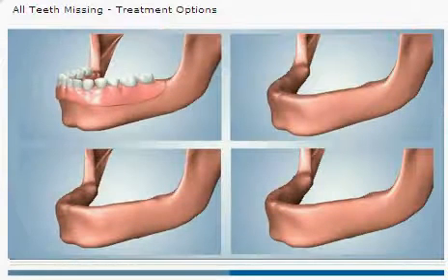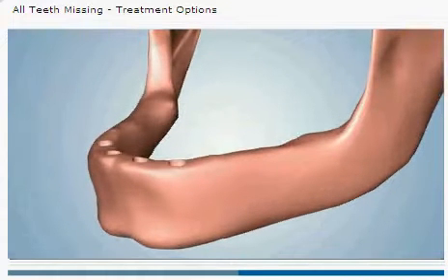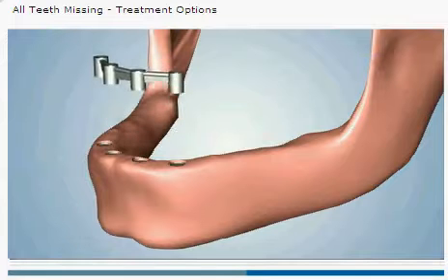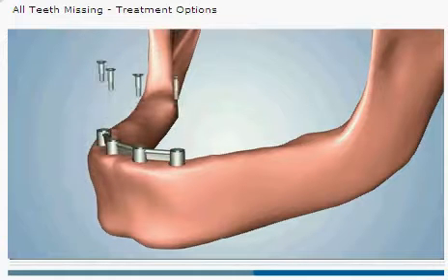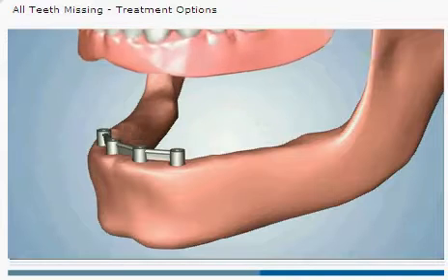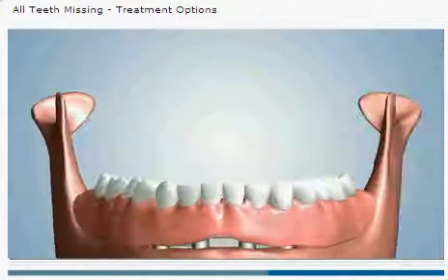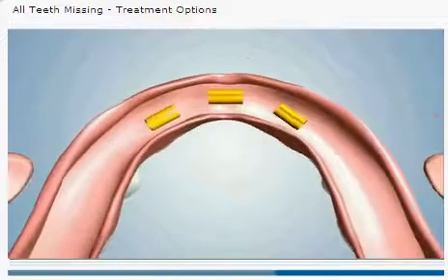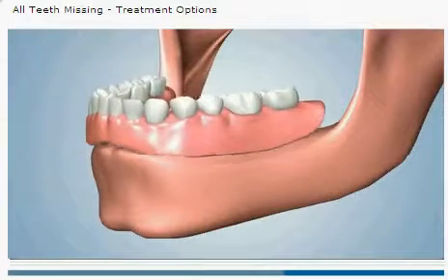A second option involves the placement of four dental implants. A customized bar is fabricated and attached to the implants. A denture is designed with clips that securely snap into place over the bar. This type of connection is known as the bar and clip attachment. This denture may also be removed by the patient for cleaning.